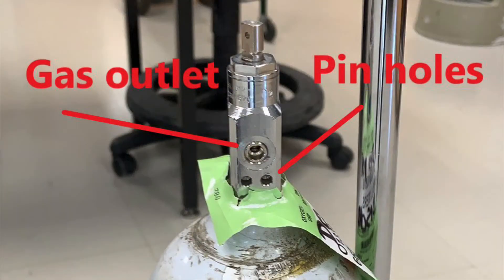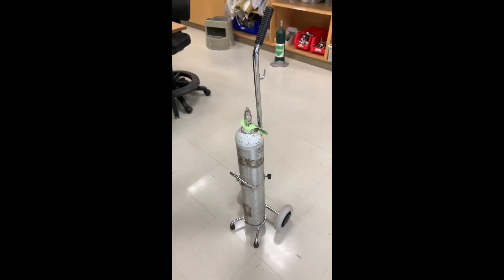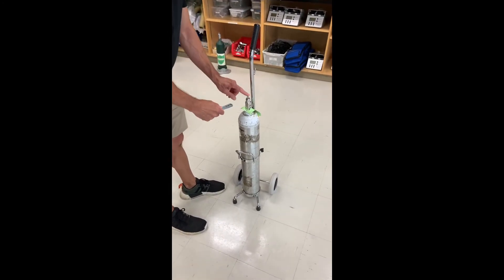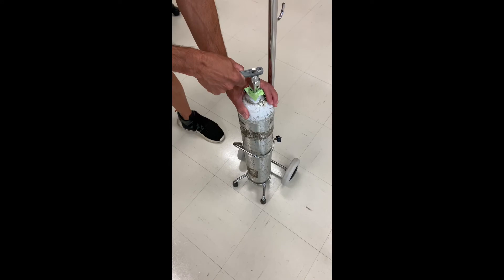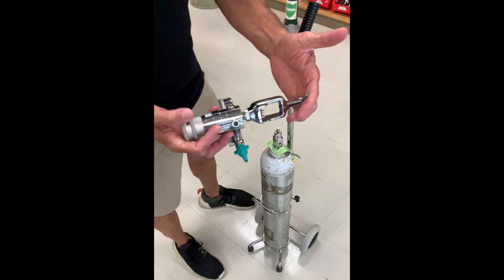This is an E-size cylinder. Cylinders this size and smaller use a pin index safety system, where pin holes allow for safe attachment of connections to the cylinder. The top hole is the gas outlet, and the bottom two holes are the pin holes for the safety system. At the very top of the cylinder post is a valve you can open and close using a cylinder wrench or key. Use the smaller opening of the wrench, put it onto the valve, and turn it counterclockwise about a quarter turn. You usually announce cracking ahead of time so other people know you're opening and closing a cylinder.